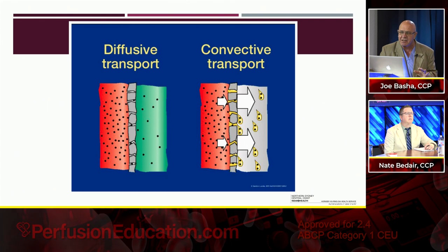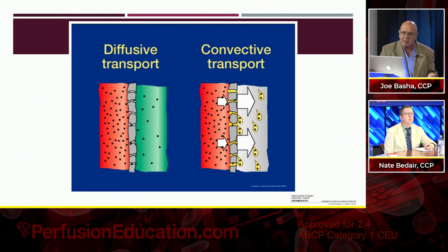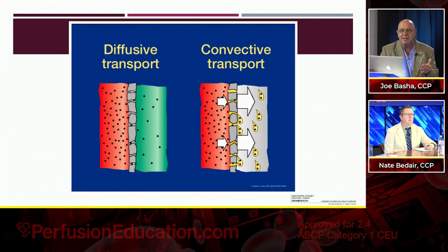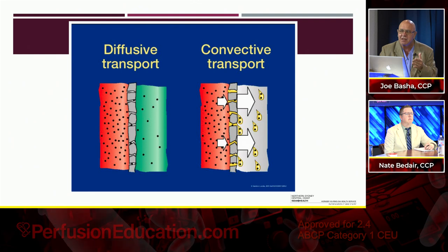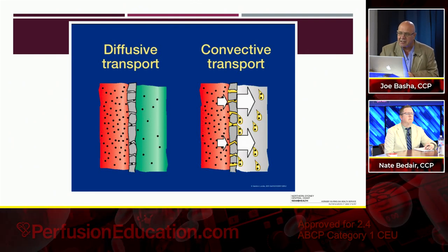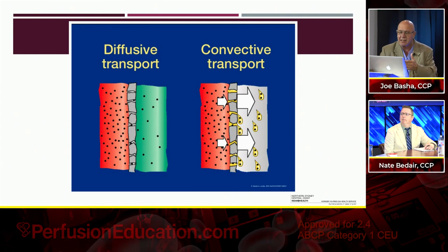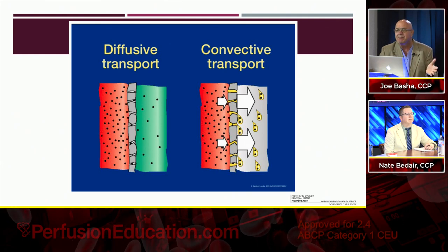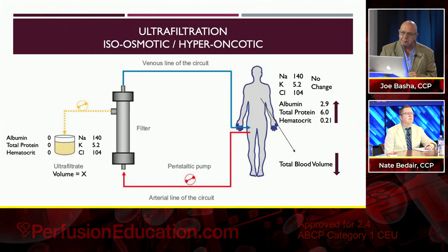There's diffusive and convective transport using a hemoconcentrator. The reason it's green on the left is because dialysate is there. That's just pure diffusion. On the one on the right, that's a hemoconcentrator. The blood's on one side. On the other side is just pressure on the blood side and no dialysate. And you see the clumps of water being pulled across with the molecules.